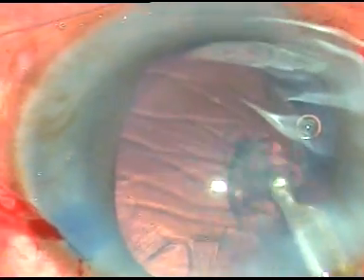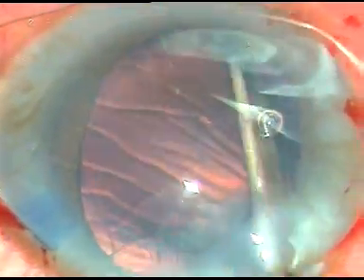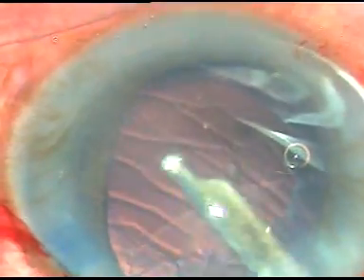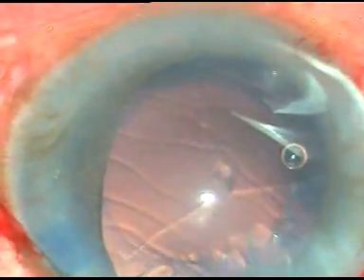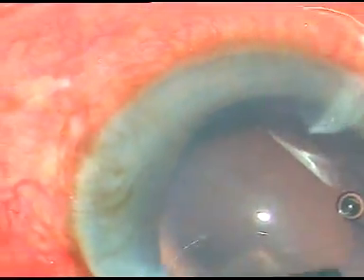One can use bimanual IA to remove the cortical matter. I also use bimanual IA, but in this case I am using a 23 gauge Simcoe cannula. Now I go through the side port to remove the cortical matter from 10 o'clock and 11 o'clock.